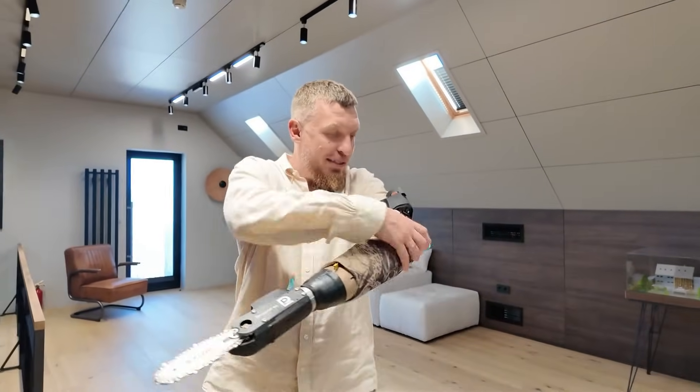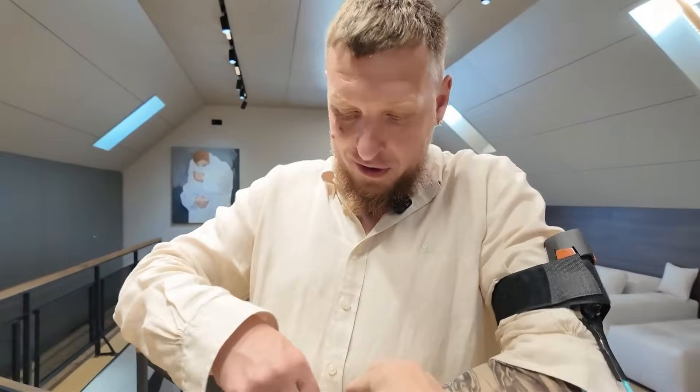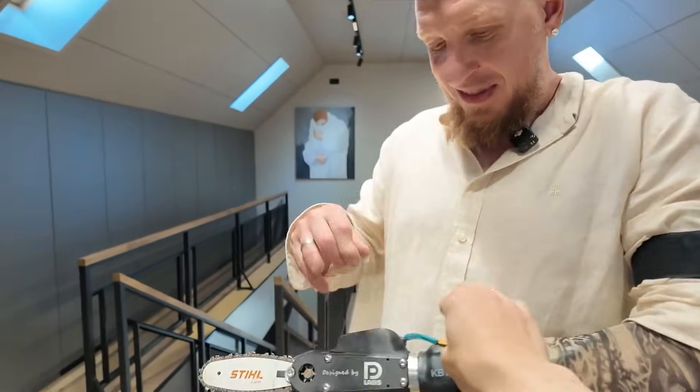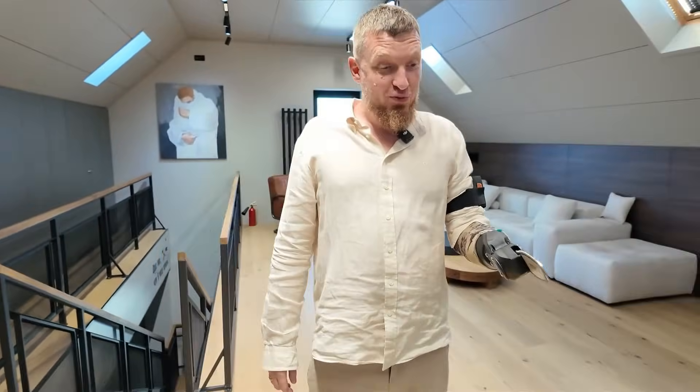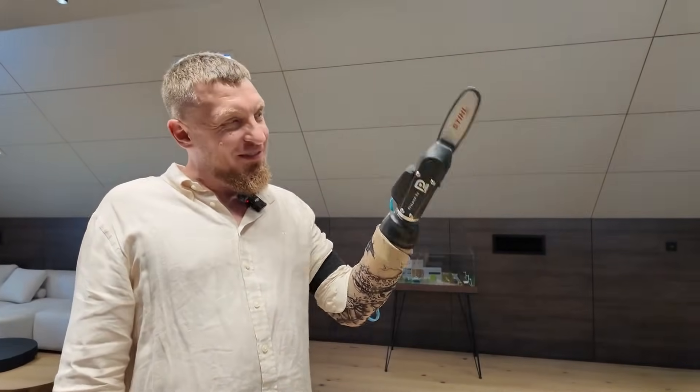Let's connect it. I had to attach the battery here. Go ahead, plug it in. Oh my god, it actually handles just perfectly. Really — dangerous thing, huh?